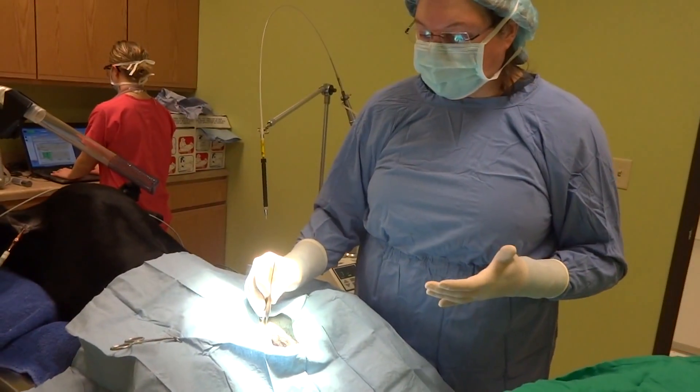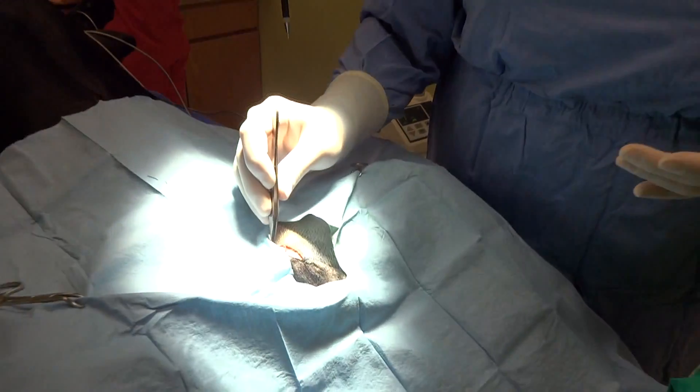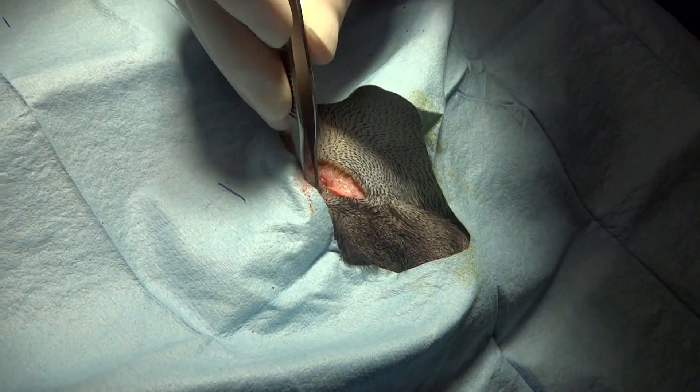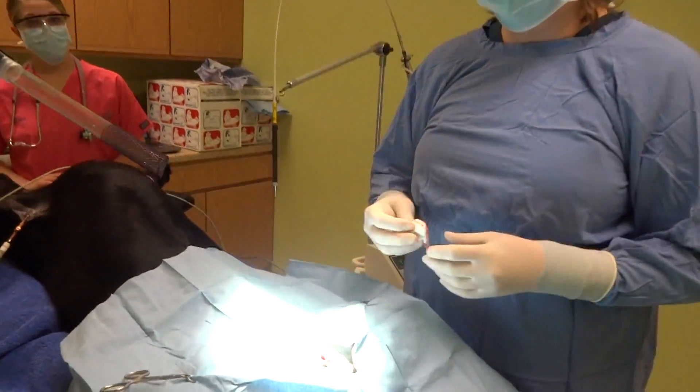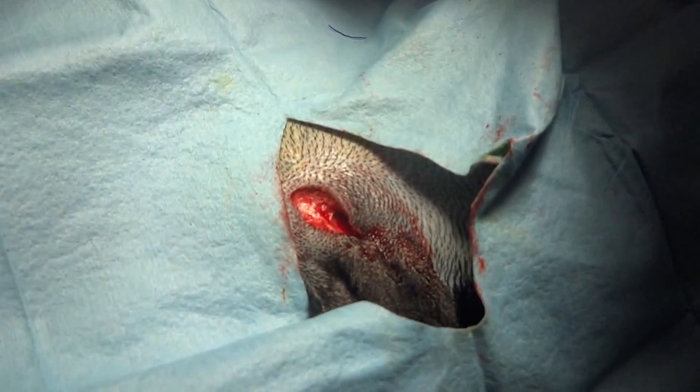We have removed the first testicle and as you can see, it is still bloodless. We now have both testicles removed and you can see there's just a minimal amount of bleeding in the incision.